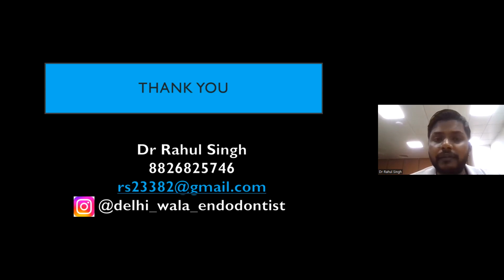And after you have put that 3 to 4 mm barrier of MTA or Biodentine, then above that you can backfill with GP. But in that backfill also, first coat the canal walls with GP with sealer, using a paper point or a GP, and then backfill the remaining canal. So first a barrier of MTA or Biodentine, then backfill with softened gutta percha, and then put your provisional or a fixed definite restoration.